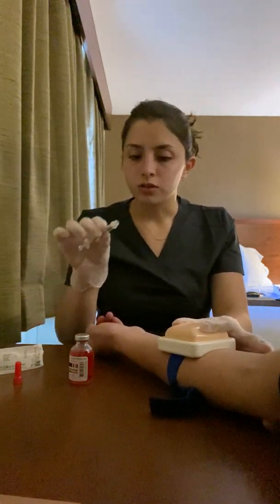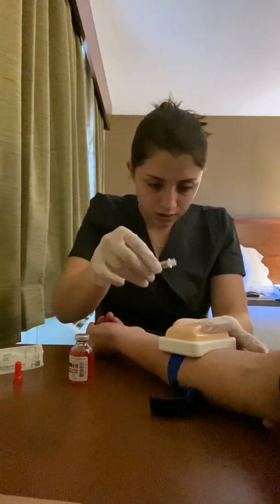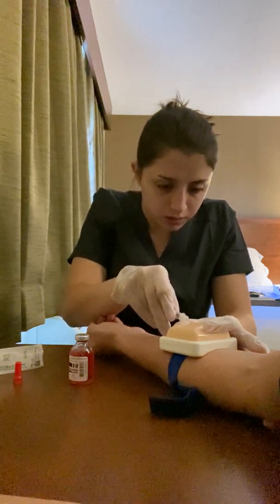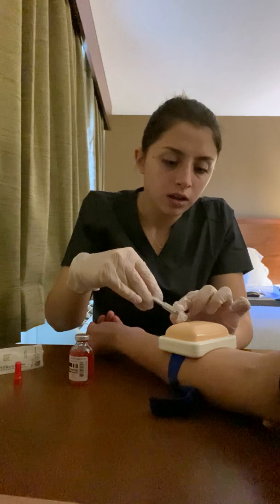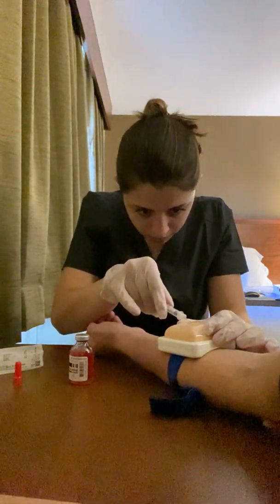And then I'm going to, with the bevel up, inject at a 5 to 15 degree angle until resistance is felt. I'm going to slowly inject the medication until I see the white bleb.